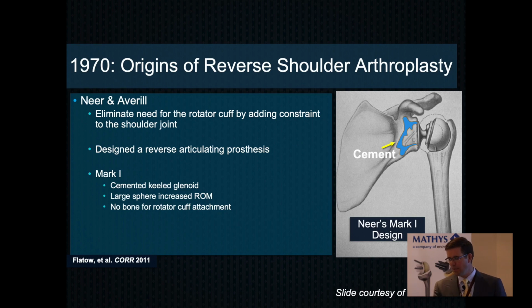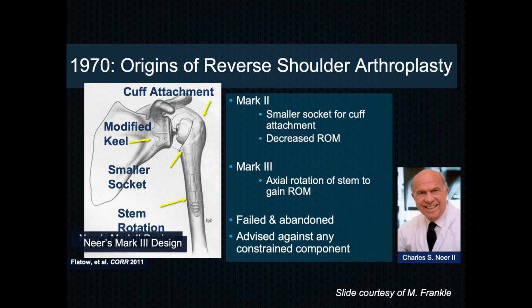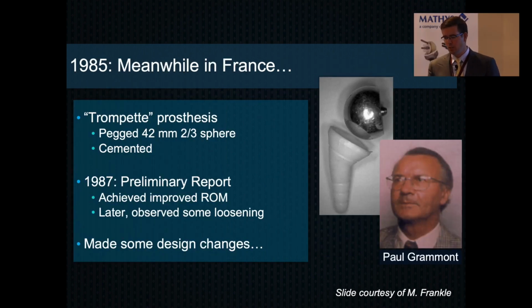Well, the reason they failed is because the fixation was not up to the task at that point. You can see these early designs with this cemented keel hollowing out the glenoid vault. The technology in the 1970s and 1980s is not what it was in the 2000s, right? The metallurgy, locking screws, these things did not exist at that point. And eventually, his design was to say, hey, wait a minute, let's give up a little bit on impingement-free range of motion, and maybe we can get something where the glenoid doesn't always fail. And that was the genius of Paul Grammont.